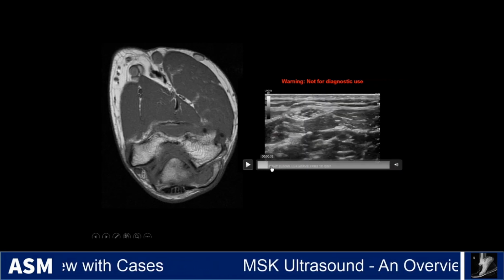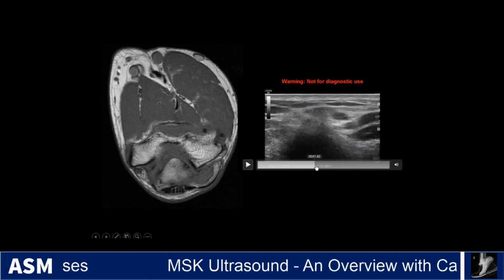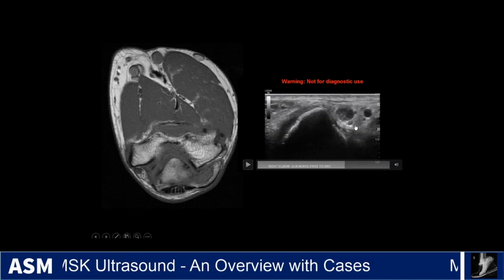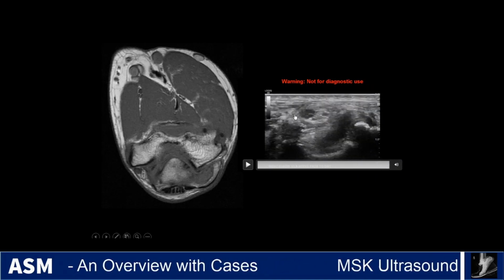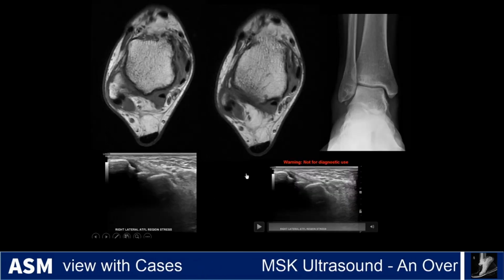And as you start coming through, you're going to see as it gets to the tunnel here, you're going to lose that fascicular architecture, and it just becomes this glob right here. Here's the medial epicondyle. Osborne's fascia would be over here. And so then as you pass the tunnel, you start to see it beginning to normalize again. So normal and abnormal appearance of the ulnar nerve.